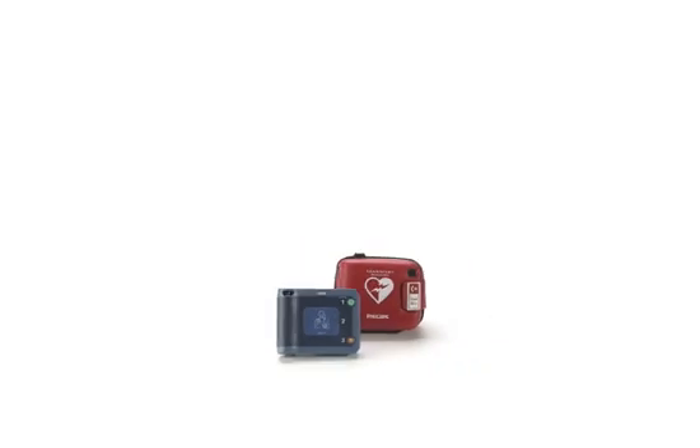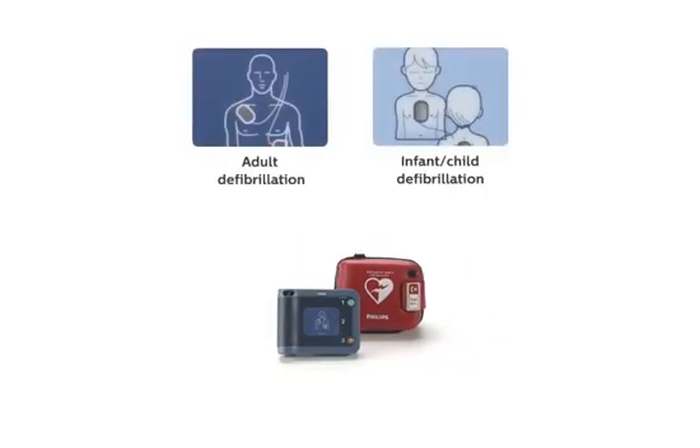To begin the demonstration, click on the appropriate type of defibrillation you are interested in learning more about—adult or infant-child defibrillation.